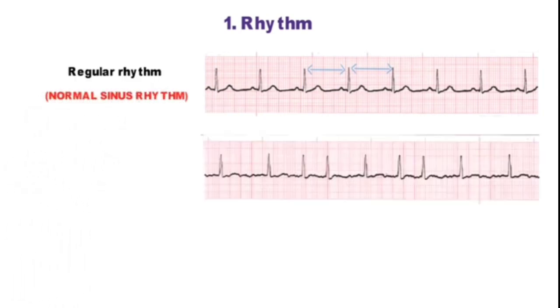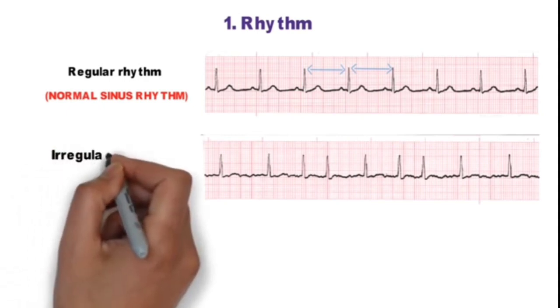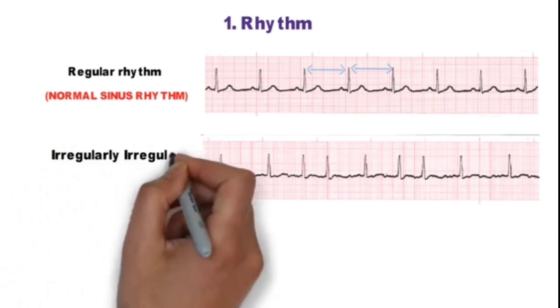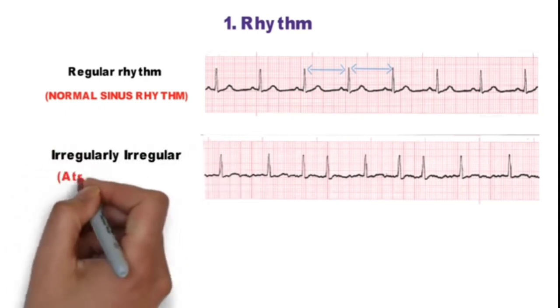In this second ECG you can see RR intervals are not equal and there is no identifiable P wave. Rhythm is irregularly irregular, which occurs most commonly in atrial fibrillation.